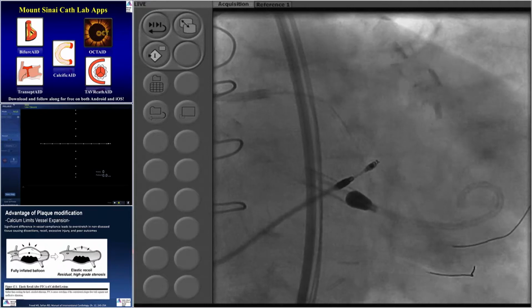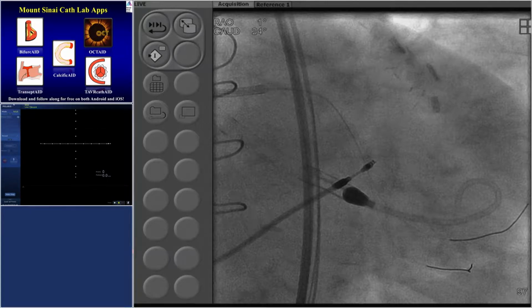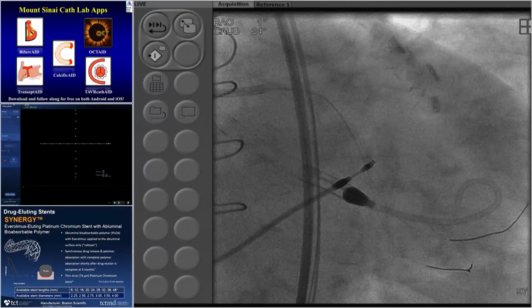Any reason for Synergy in this particular case? There's nothing special. Any stent, I would say, all stents will be equal in this situation. The only question that remains for the left main is that we really need to have some more data. We know the data for Xience quite a bit, but whether we have equally good data for other non-Xience type of stent in the left main.